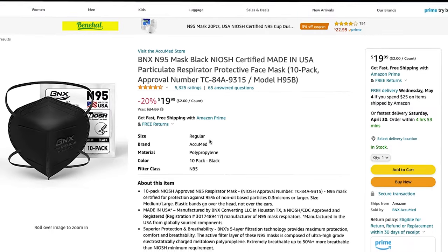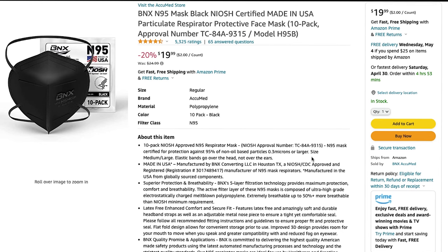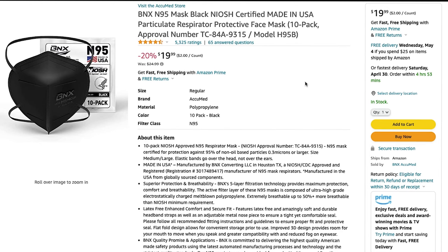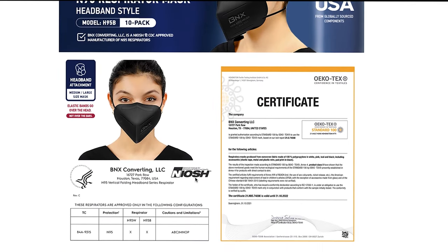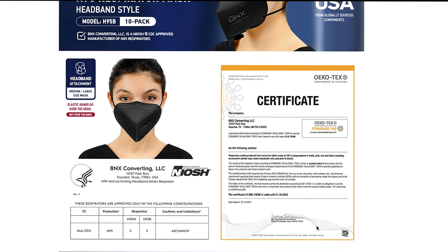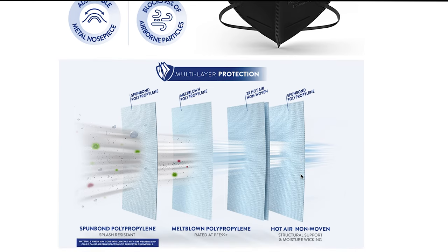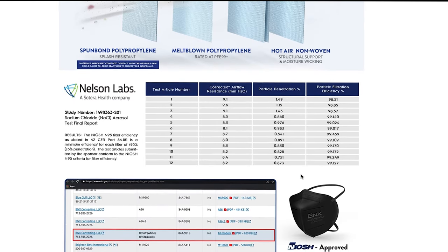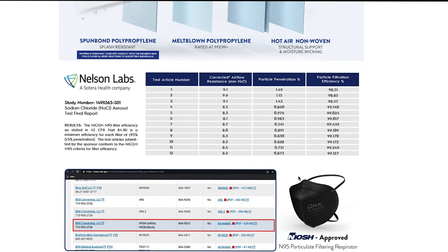Let's go over the listing before we move on to the testing portion. This is the N95 Black NIOSH certified, made in the US particle respirator face mask in a pack of 10. It comes with your TC approval number and model H95B. They have a 4.5 out of 5 rating. The seller is BNX Acumet which is our account. Scrolling down in the product description you can see an OEKO-TEX certification — an independent third-party tester of fabric — and it shows the five different layers this respirator has. Lastly it also contains the Nelson Labs results, which not a lot of listings include.